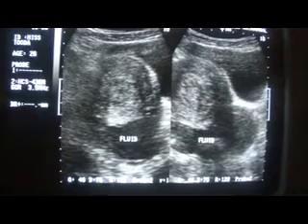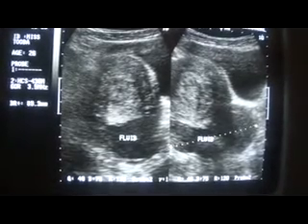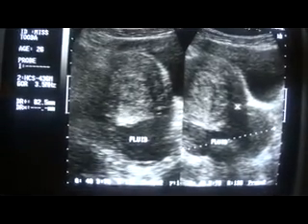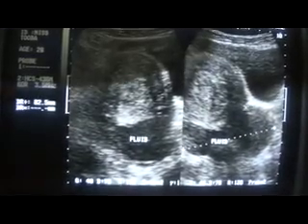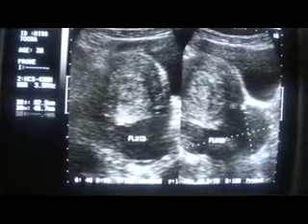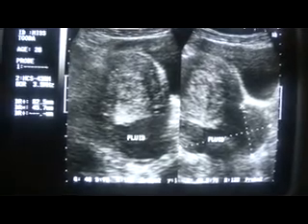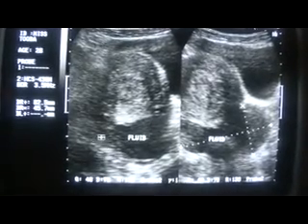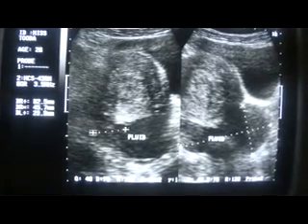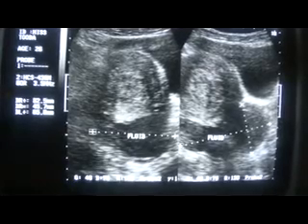So this is our case of the day. Do comment, do suggest any other possibility of finding. So we are done with this ultrasound.